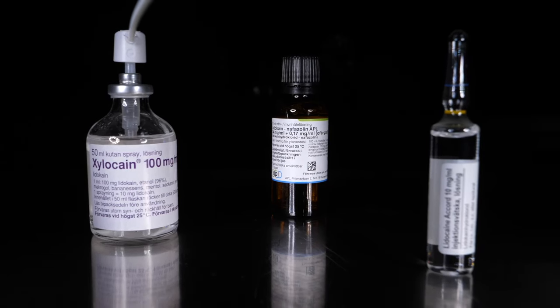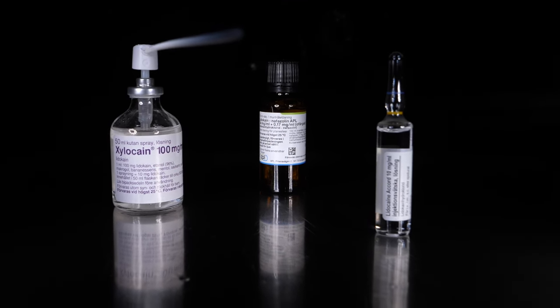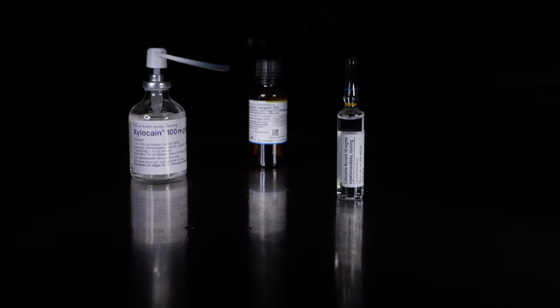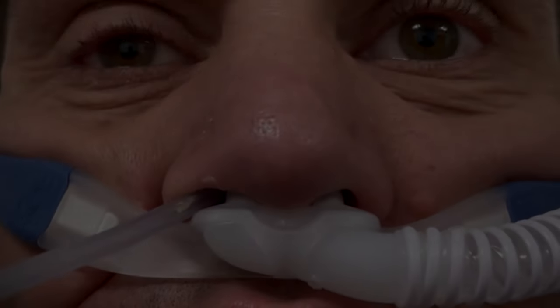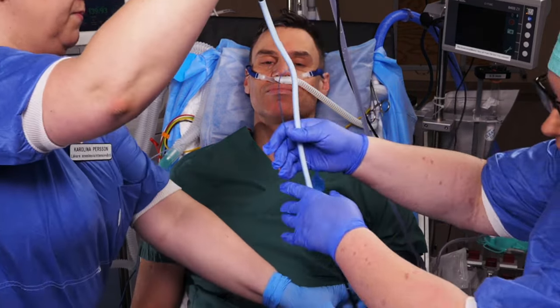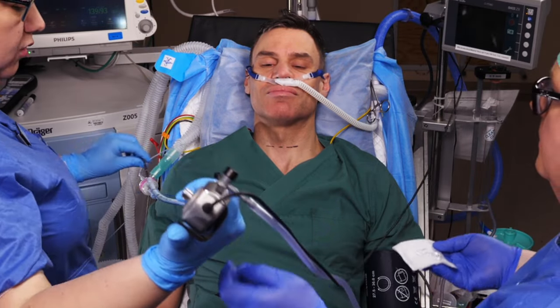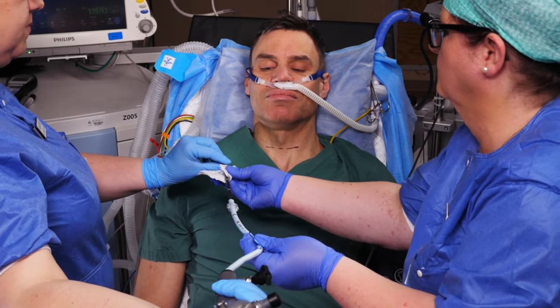Do consider the maximum doses of local anaesthetics, especially if there is other imminent use, for example wound infiltration by the surgeons. Test the anaesthesia of the nasal cavity by carefully inserting a suction catheter. Now perform the intubation. Stand in front of the patient with your arms at a comfortable level, using an elevated platform if necessary to avoid working above your shoulder height. Lubricate the bronchoscope and fixate the ET tube.